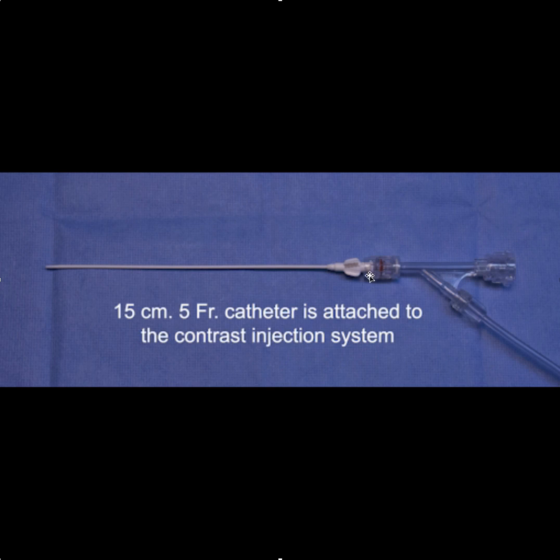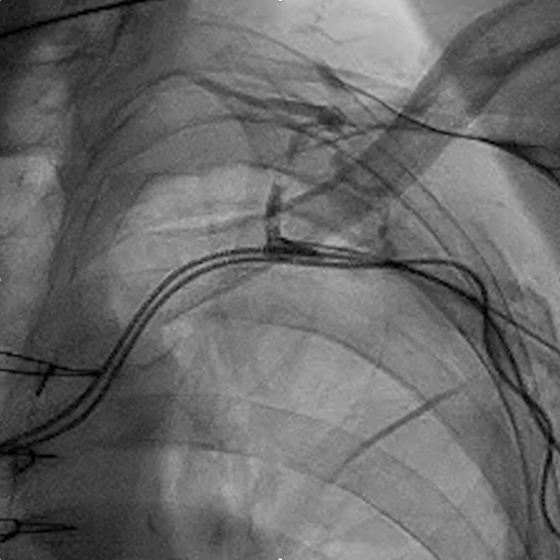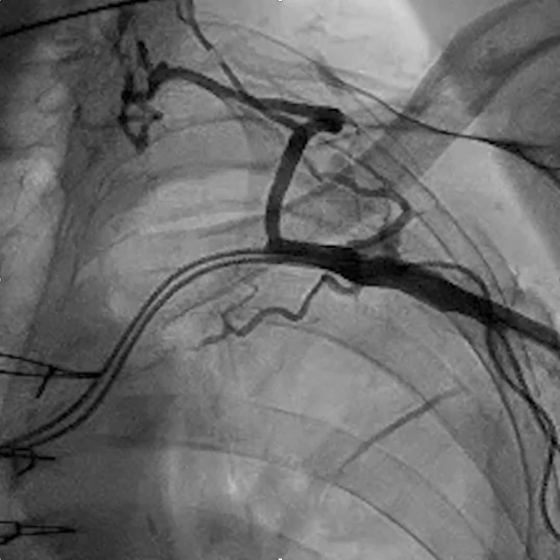We'll attach the contrast injection system to the 5 French catheter so that we can inject contrast and then insert a wire through the hemostatic valve. We're injecting contrast here to see what the situation is, and you can see what appears to be a total occlusion of the subclavian at that point.